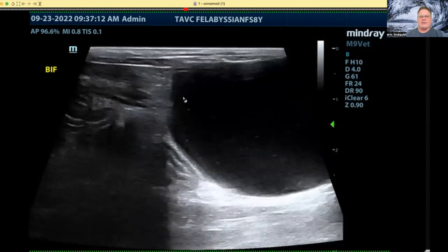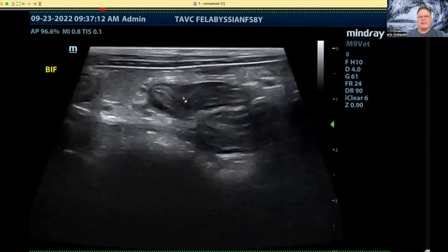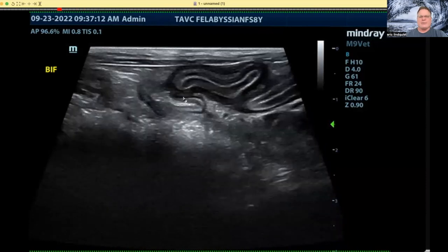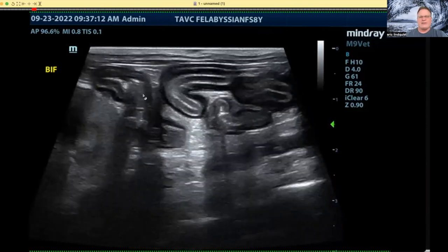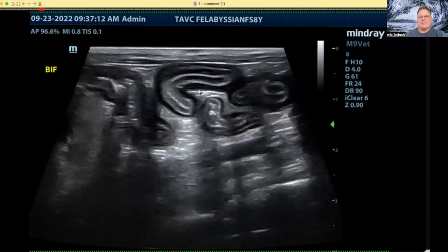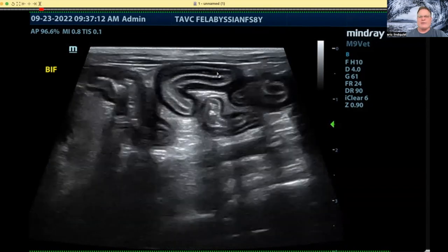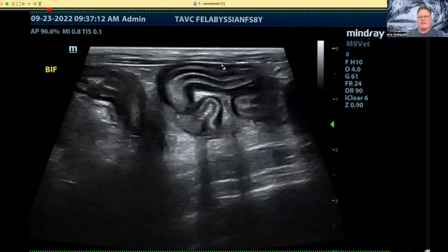This is an eight-year-old Abyssinian cat that's a chronic vomiter, losing weight, ain't doing right. When we see this intestinal thickening, let's count the layers — count from the outside in. You have the serosa layer, followed by the hypoechoic muscularis, followed by the thin hyperechoic submucosal layer — that's your surgical holding layer — and then your mucosa.